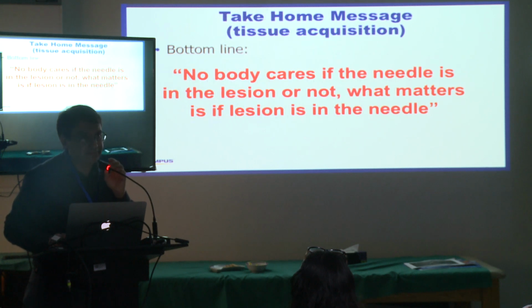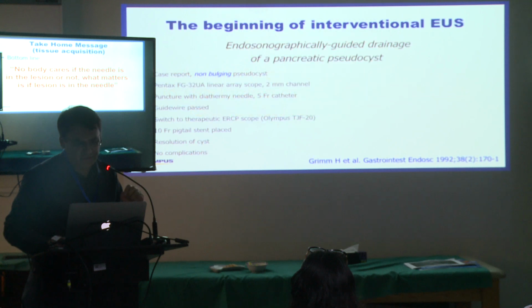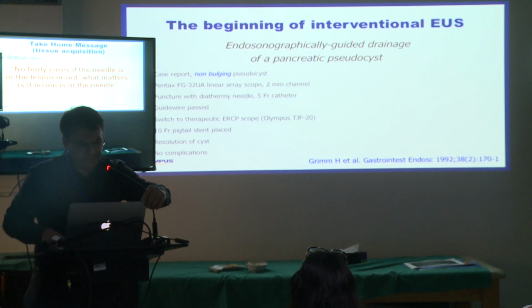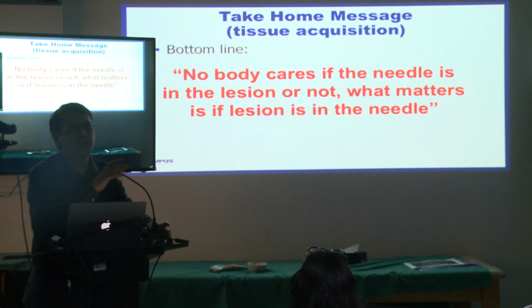Okay, I said this earlier too. Nobody cares if the needle is in the lesion or not. What matters is if the lesion is in the needle or not. Okay, the next part of this talk is about the intervention, so I don't think we need to go into that.